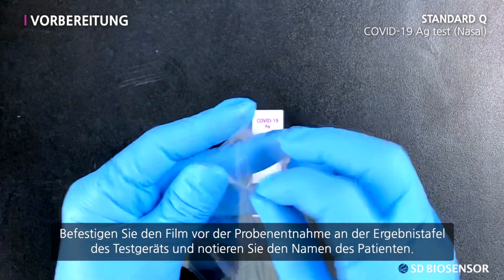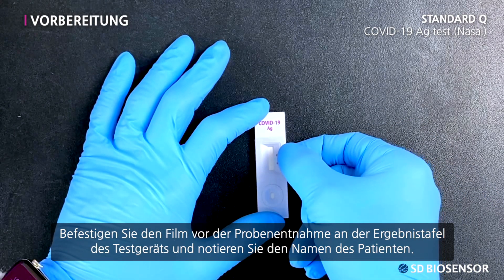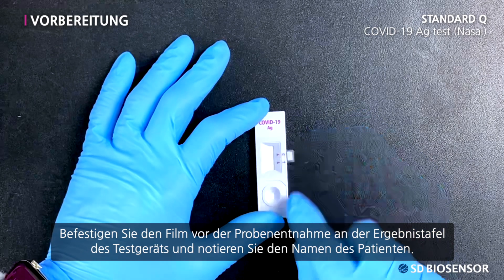Before collecting the sample, attach the film to the result window of the test device and write down the patient's name.